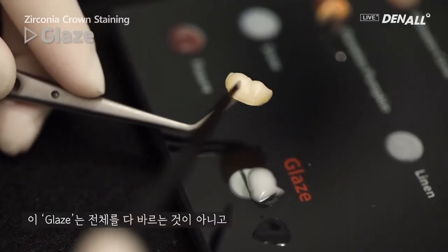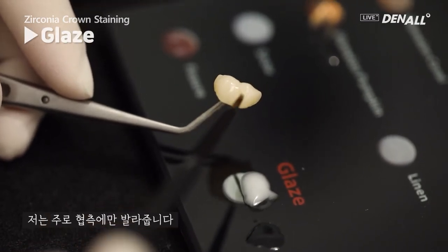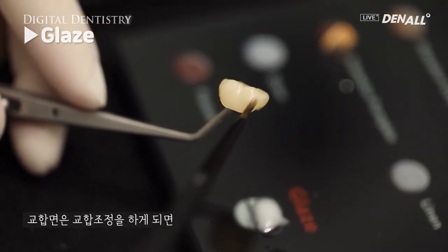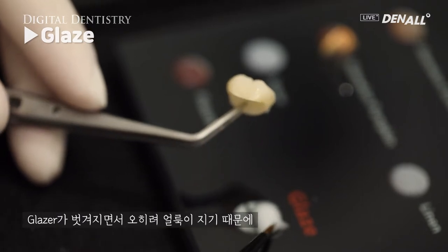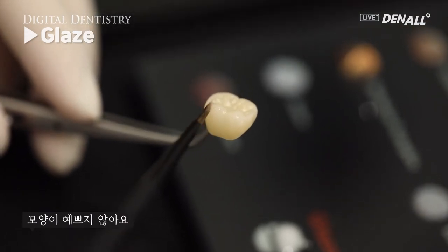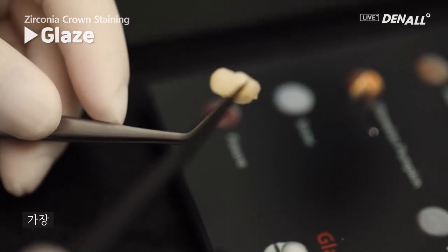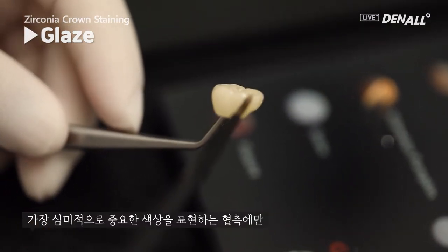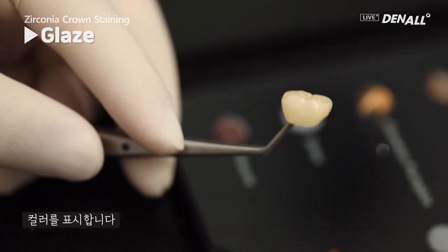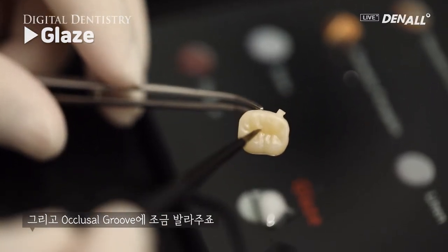The glaze is not to be applied all over. I usually use it on the buccal side only. The occlusal surface under occlusal adjustment can have the glaze peeled off — that's not good. Therefore, it is done on the buccal side, which is the most important color aesthetically. The color is added on the buccal side and a little bit on the occlusal grooves.